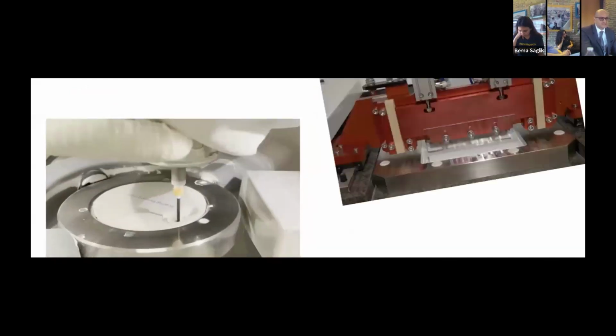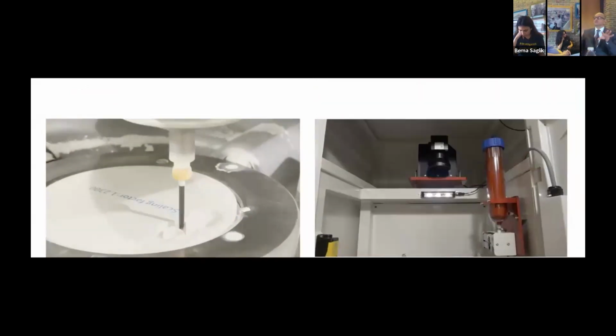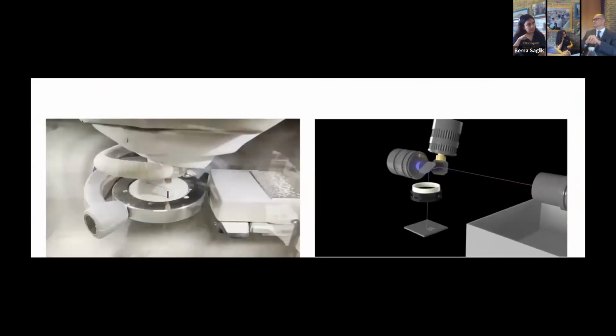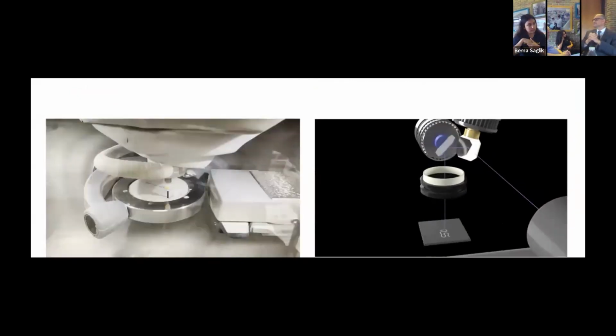So based on what I said so far, are you convinced to use 3D printing rather than milling? Be very honest. Tell me yes or no. Let's review it quickly together. The mechanical properties were almost the same. The marginal fit was not the same, or not getting the same. So what is the rationale to use it? At this point, I'm not convinced.